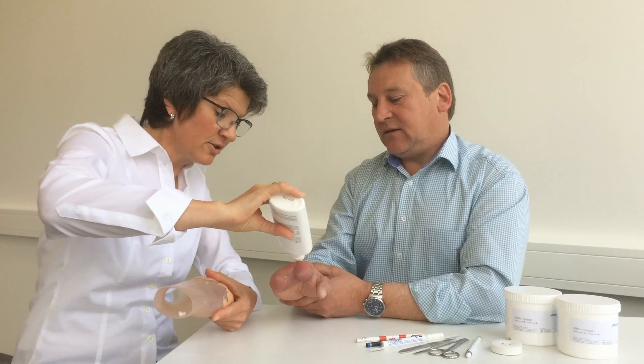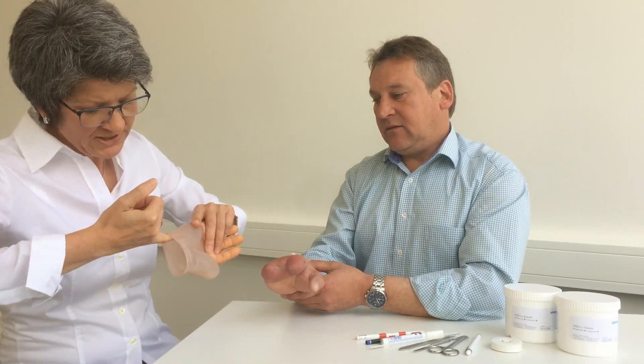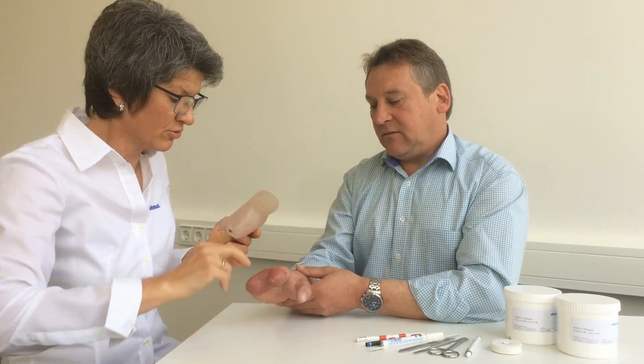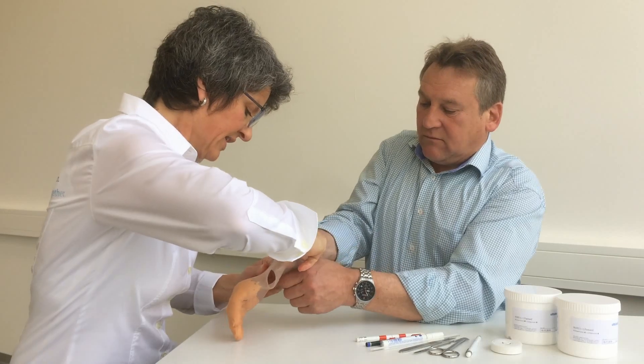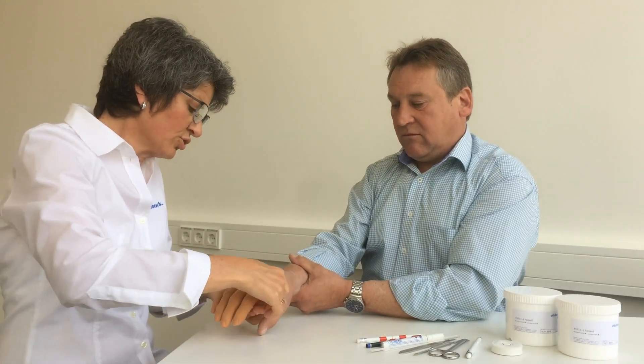First, I apply a bit of ProComfort gel to the inner brim and the hand to make it easier to put on the prosthesis. I make sure not to stretch the brim too much and massage the extra gel towards the socket brim.